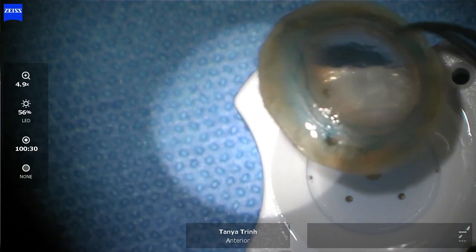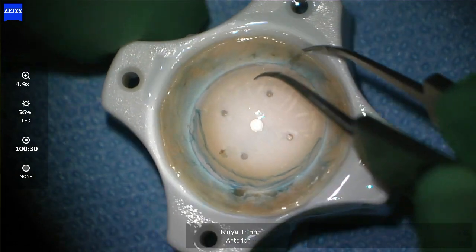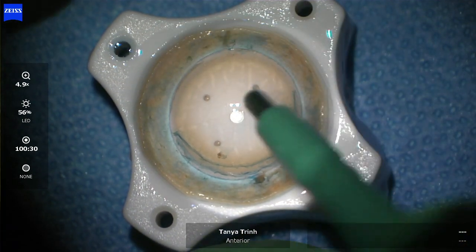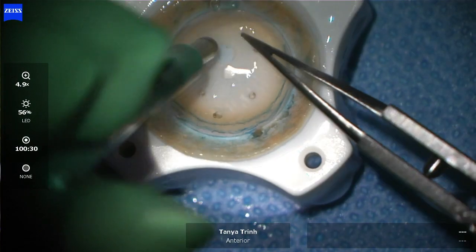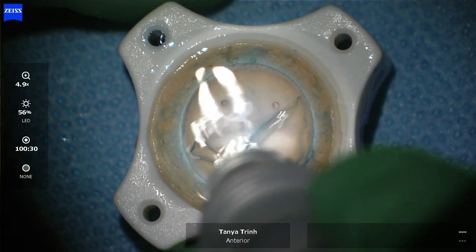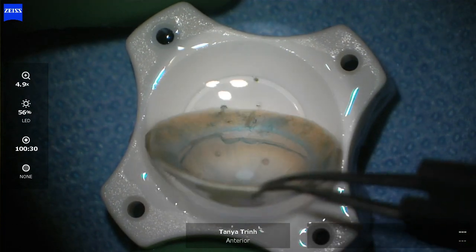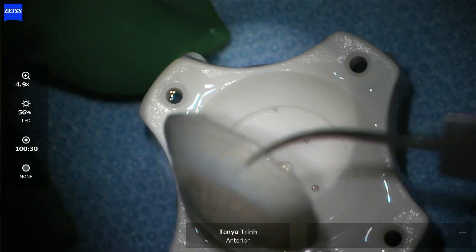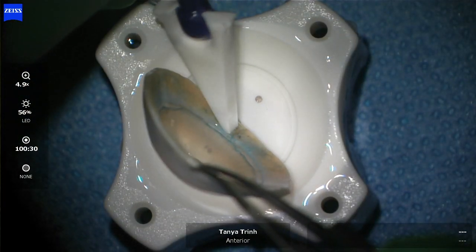My endpoint is getting just across the halfway point of where the central aperture — the hole — is at the trephination base. I'm wicking off any excess fluid, and this just allows my transplant to sit nicely in a taco formation without accidentally running into the area where I'm about to punch. I place the fold orientation so that I'm able to punch between the two smaller holes, allowing a complete cut with no risk of incomplete edges. I use balanced salt solution to float the tissue back into position and then place it upright after working off any additional fluid.